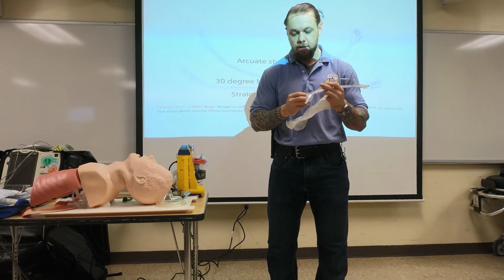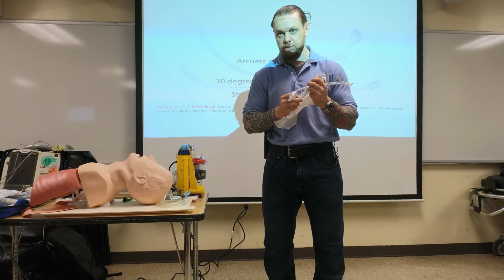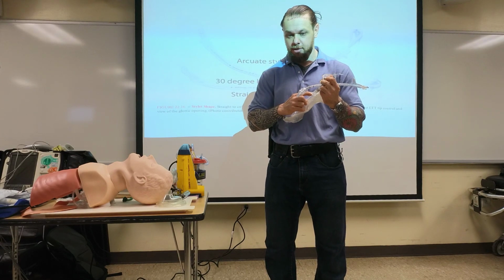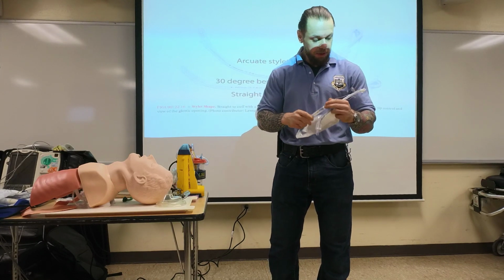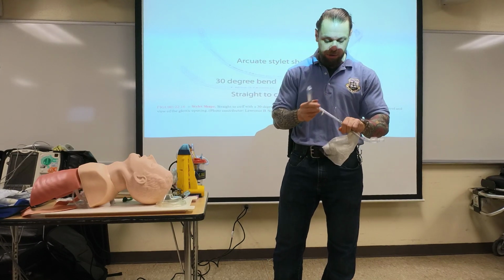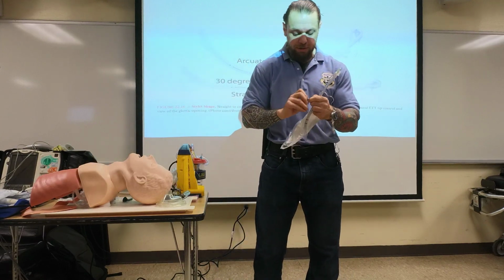This is not an anchor. This is just to make sure the tube is in the right place and there's no secretions going to go behind it, so less chance of aspiration with this tube. It doesn't keep it in place. You push air. You do not push saline in it. Air. This is a stylet, you could adjust it.